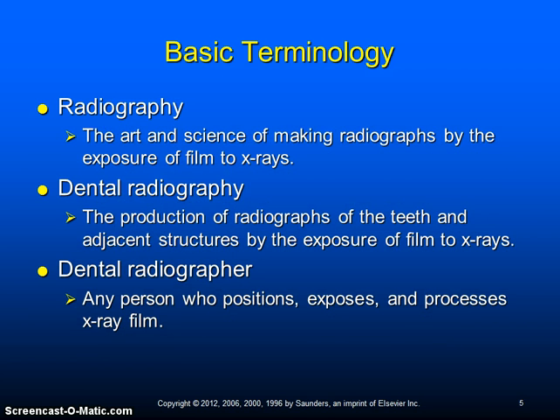Radiography is the art and science of making radiographs by the exposure of film to X-rays. Dental radiography is the production of radiographs of the teeth and adjacent structures by the exposure of film to X-rays. A dental radiographer is any person who positions, exposes, and processes X-ray film. This could be a dental assistant, a dental hygienist, or a dentist.